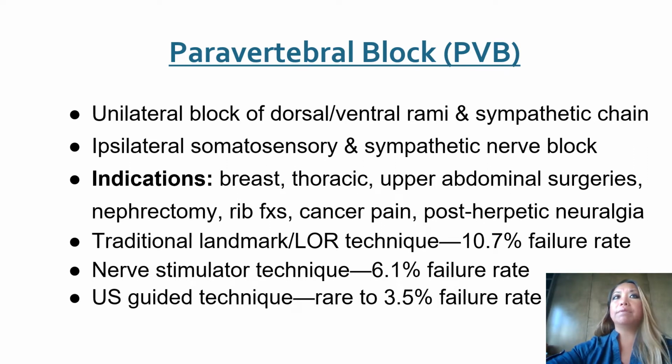There are many ways of doing a paravertebral block. The traditional loss of resistance technique has about a 10% failure rate. That's improved with the addition of a nerve stimulator, and the newer ultrasound guided techniques are very safe and effective.